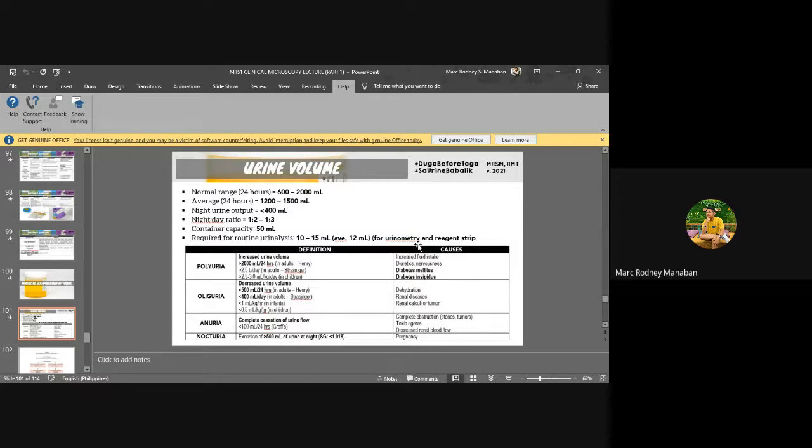Okay? Now, take note, dears, before I forget, about the preservatives, I haven't mentioned, there is no single best preservative for your urine. It would only depend on the need of the laboratory and on what analytes you want to examine. All right? So the preservative you use will matter here. But in terms of the single best, there is none. But the preservative of choice for routine UA and even culture is refrigeration. All right? Okay. I just emphasized that. So that's for your urine volume.